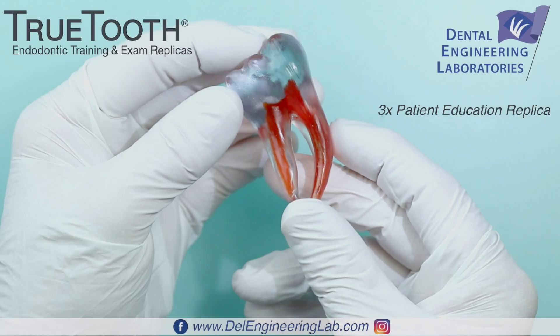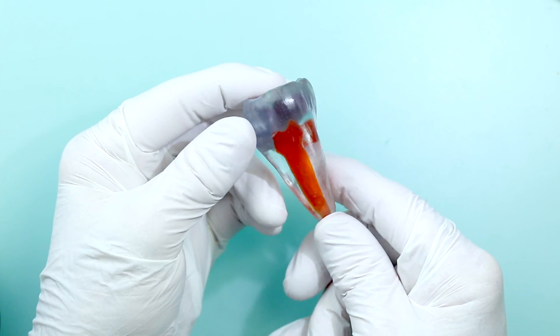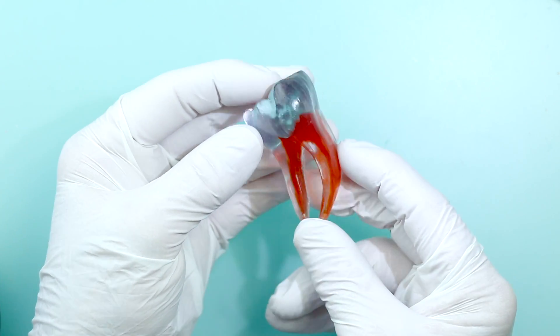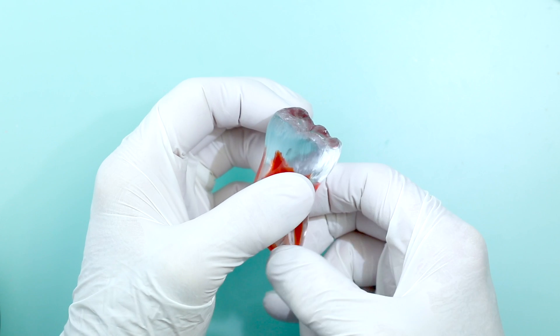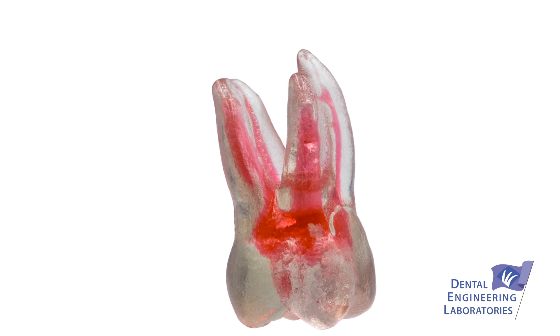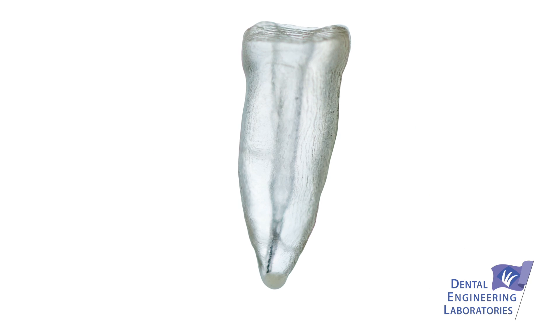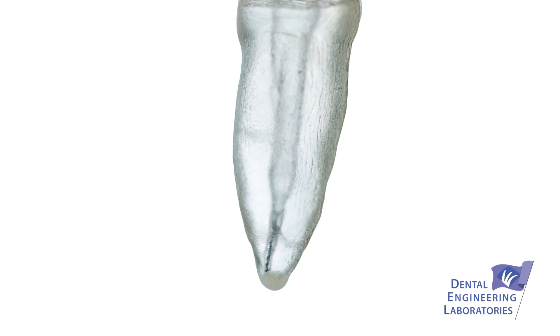Here at Dental Education Laboratories, we've come up with something truly unique, something totally new in dental education — something we call True Tooth Replicas. These are 3D printed replicas of actual dental anatomy. They come in clear and they come in opaque models.